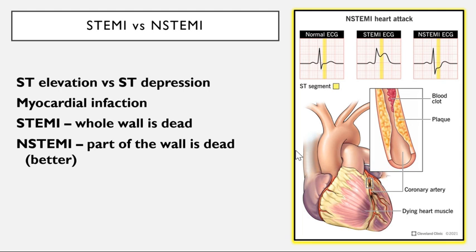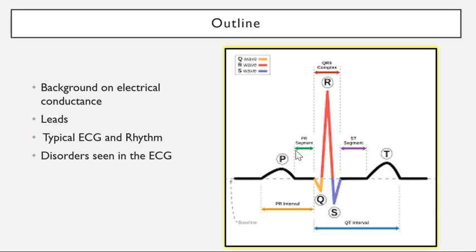All right, the last one, sorry, this isn't the last one, but this one we've seen as well with STEMI versus NSTEMI. What's going on here is you're looking at the ST segment and whether or not it's elevated or dipping down. Normally it should be flat just after that depolarization, while it's waiting to be repolarized. But if it's elevated like that, it's a STEMI. So just be able to recognize that, right? We talked about those last lecture pretty extensively.